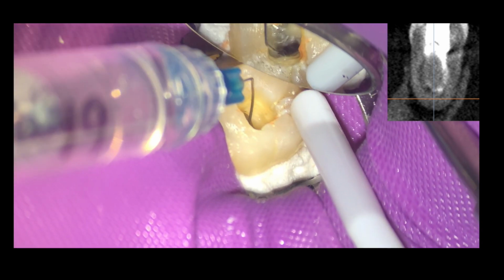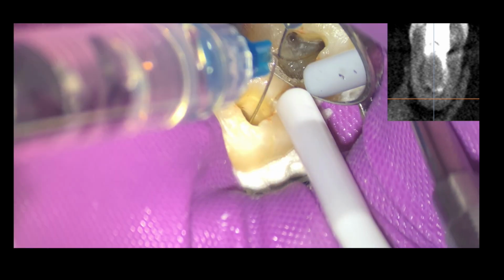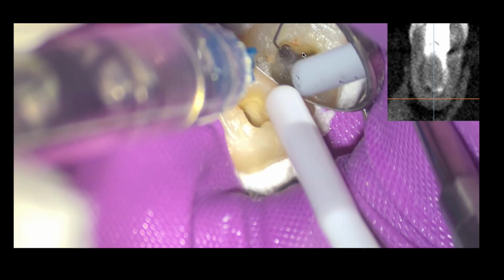So sometimes what happens is, that's a great indication that not always do these things play by the rules that you think they're playing. So what does that tell me? It's like, oh, well, I know that they join, so I've got to clean that out even more to make sure that all that debris is out of there. That's the beauty of having a cone beam. So that's the one thing I wanted to take away from that.